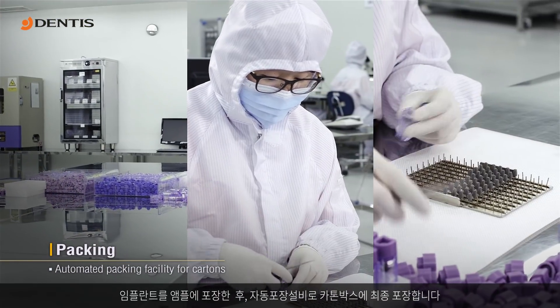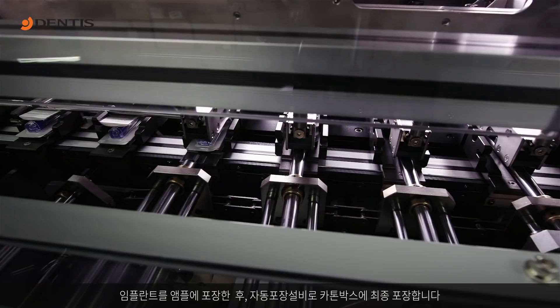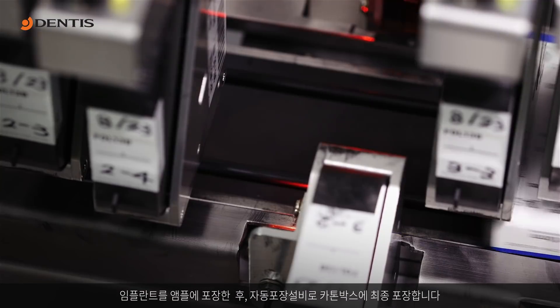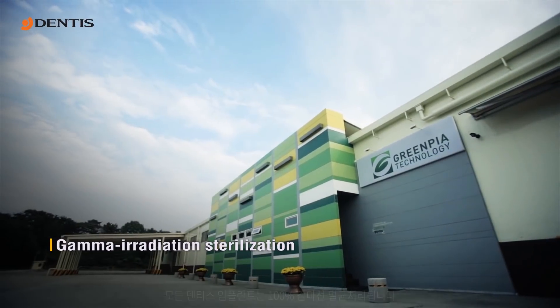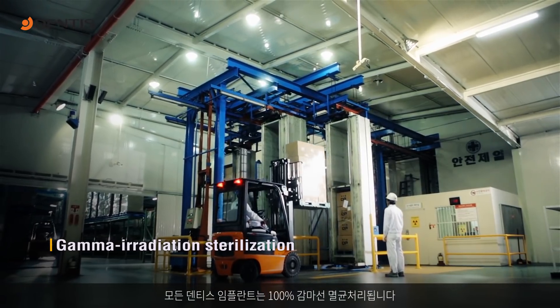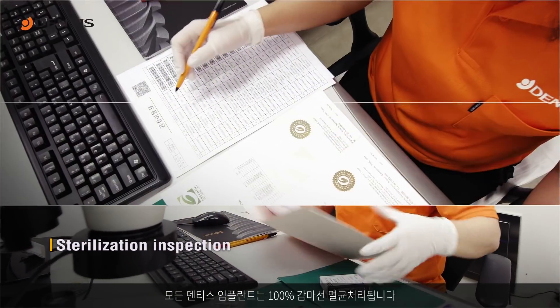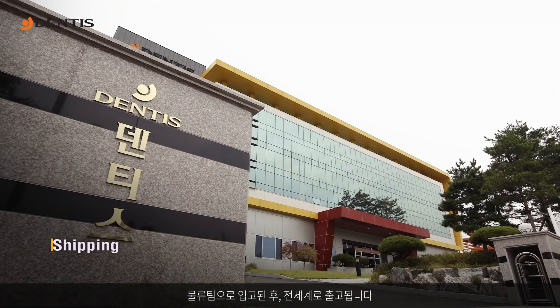The implants are packaged into ampules, which are then automatically packaged into cartons. After the final inspection, the implants are sent for sterilization. All dentist implants are 100% gamma irradiated sterilized and are then sent to the logistics team for global shipping.